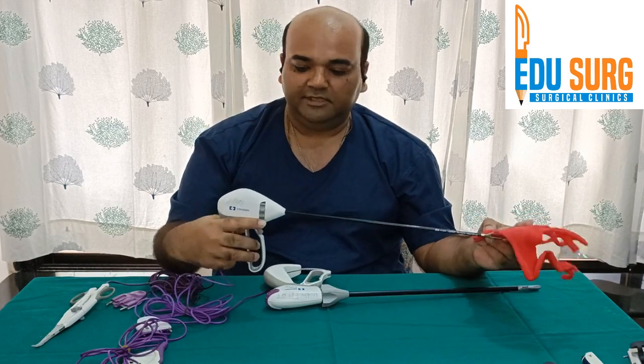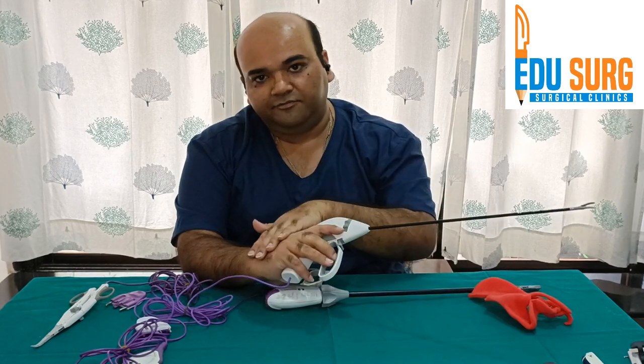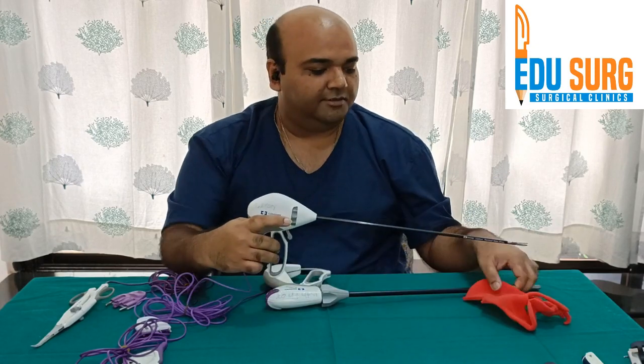Let me show this again. This is how you hold this instrument: your thumb on one side, the other fingers on the other side, and these fingers on the knob. The index finger is kept free — I will explain why later.